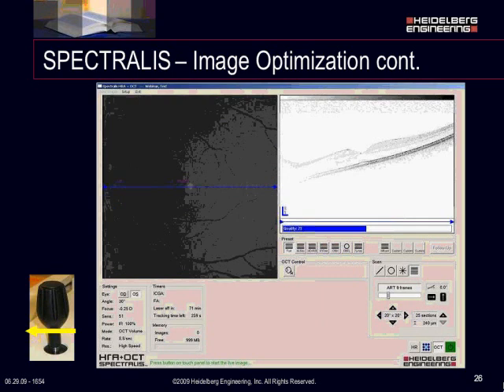What we're trying to accomplish here is the RPE layer, down on the bottom, the dense black layer. We want to get that evenly dense from left to right as best as possible. When you do that, the blue quality bar will also move up and down. So you can do one of two things: look at the quality bar and get the best quality you can, or look at the retinal pigment epithelium and get that nice and evenly dense. That's what I like to do.